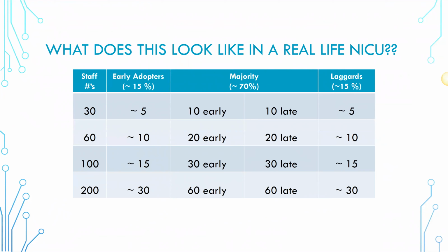All right, so now if we know who we're going to apply it to, we made some sort of decisions around that, then we need to think about when to apply, where to apply, how to apply. So I think one of, again, the short stick situations that come up is who will place the sensors. And I would say that 99% of the time, this is a task that is assigned and taught to bedside nurses or advanced practice nurses, the fellows who are in the unit all the time.